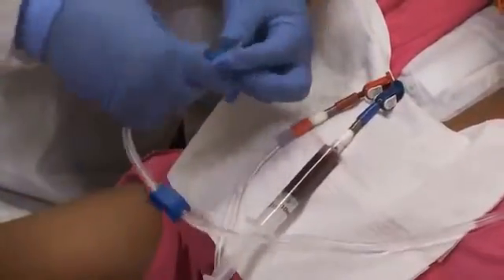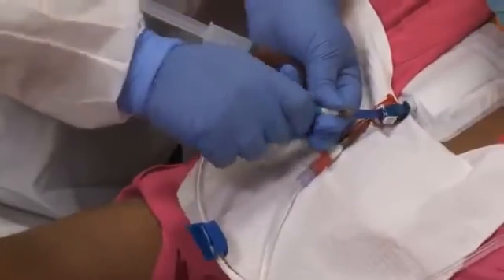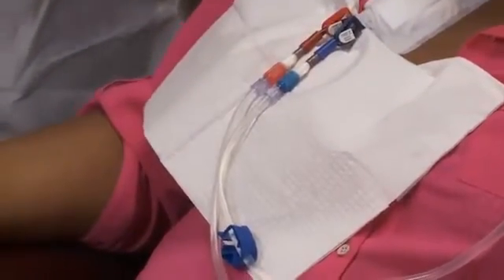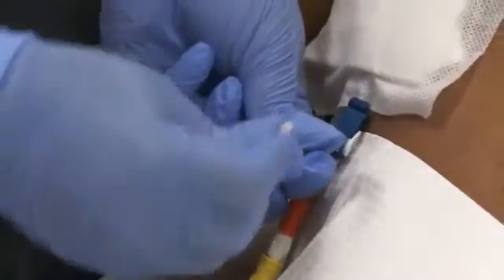Connect the catheter to the blood lines using aseptic technique. Unclamp the catheter only after it's connected. And remove your gloves and perform hand hygiene. If any of your patients use a needleless connector device on their catheter, you should follow the manufacturer's recommendations for that type of device. When the patient has completed treatment, the same care should be taken using the scrub the hub procedure for catheter disconnection.